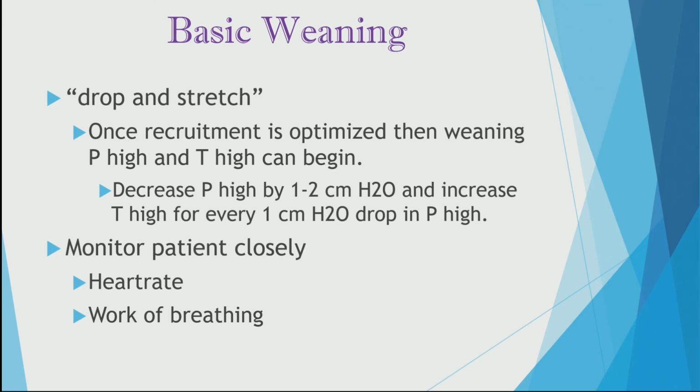There is no need to go back to a conventional mode of ventilation once you have begun weaning and gotten to that area or time on APRV, because you're basically on CPAP anyway. So why not just change to a CPAP and pressure support? No need to go back to conventional ventilation.